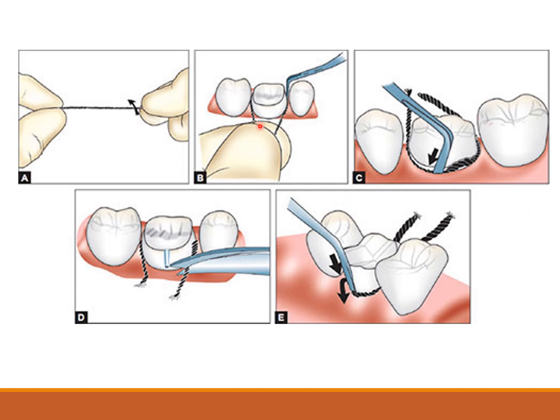So you take the cord, you measure it around the teeth, you twist the cord, you cut the excess, and start packing with the mesial. You take the cord packer from the mesial to the distal, subgingivally, with a pushing motion. This is already placed in, this is out. So going from mesial to distal, the excess is cut and it is pushed, the impression is made and then the cord is taken out later.